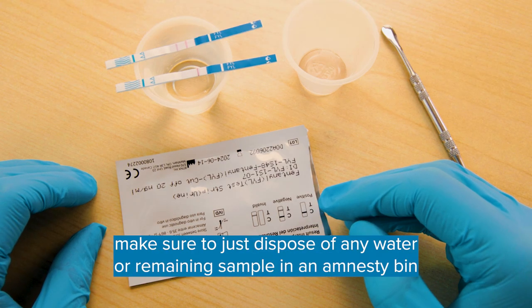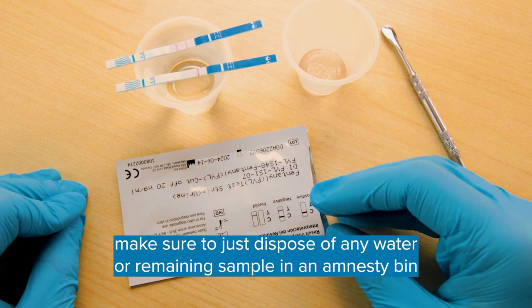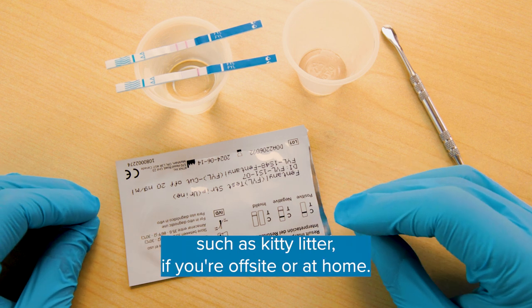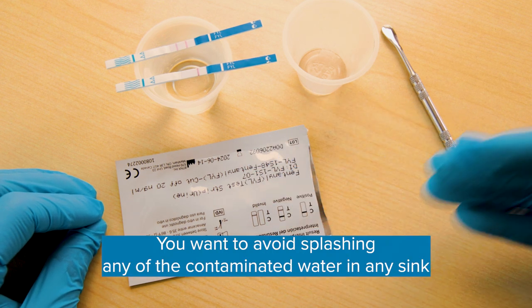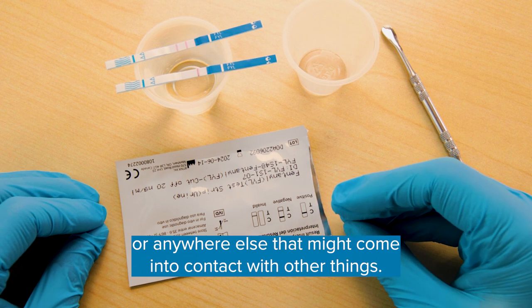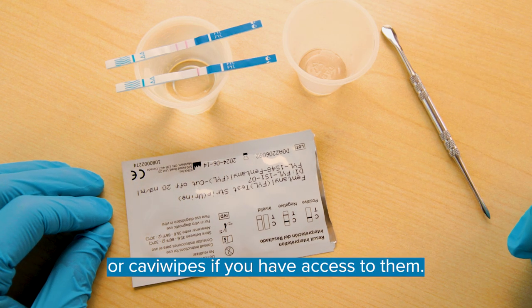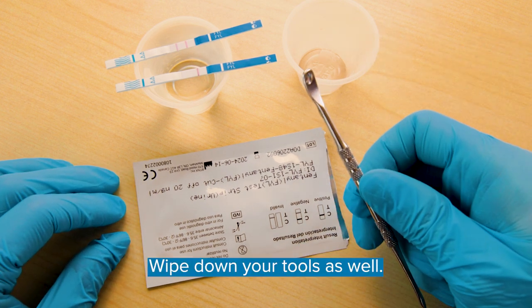When the test is complete, make sure to dispose of any water or remaining sample in an amnesty bin or a Daterra pouch if you're on-site, or in an absorbent medium such as kitty litter if you're off-site or at home. Avoid splashing any of the contaminated water in any sink or anywhere that might come into contact with other things. Make sure to wipe down your work area with alcohol swabs or cavi wipes if you have access to them.